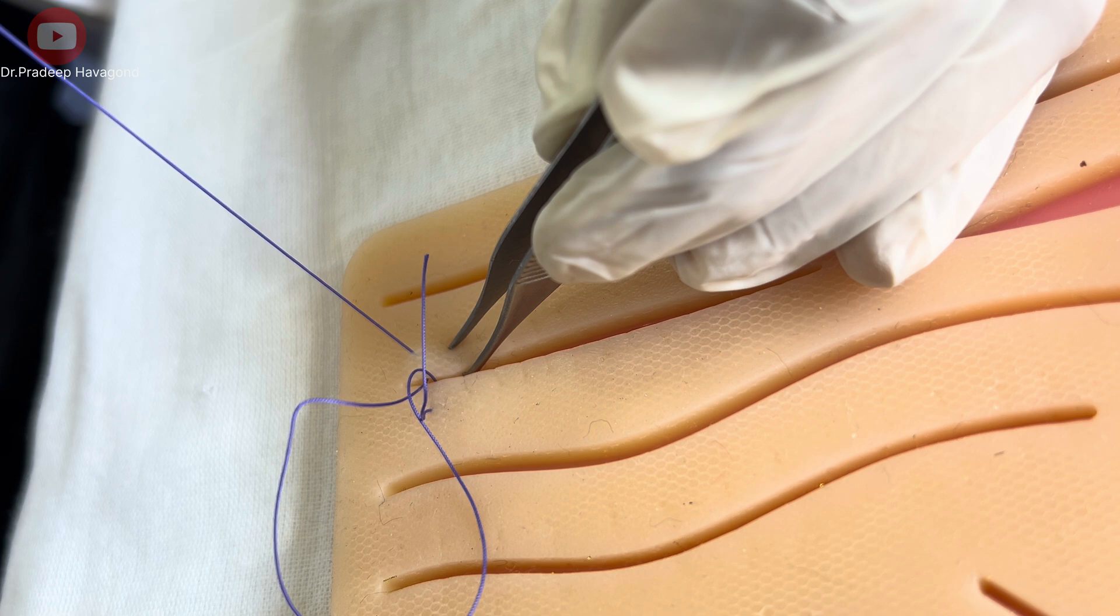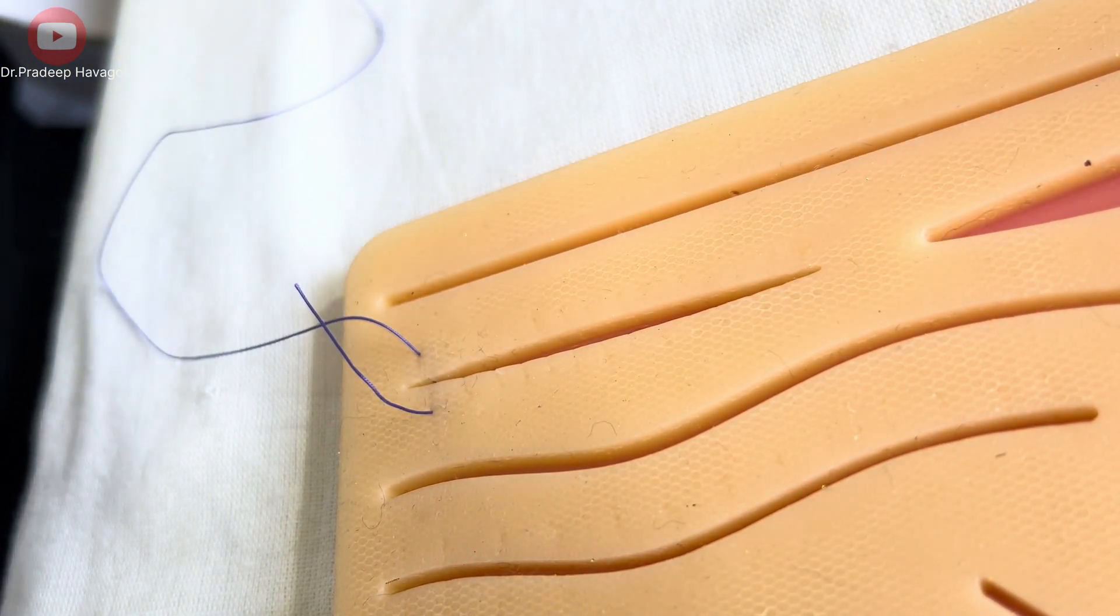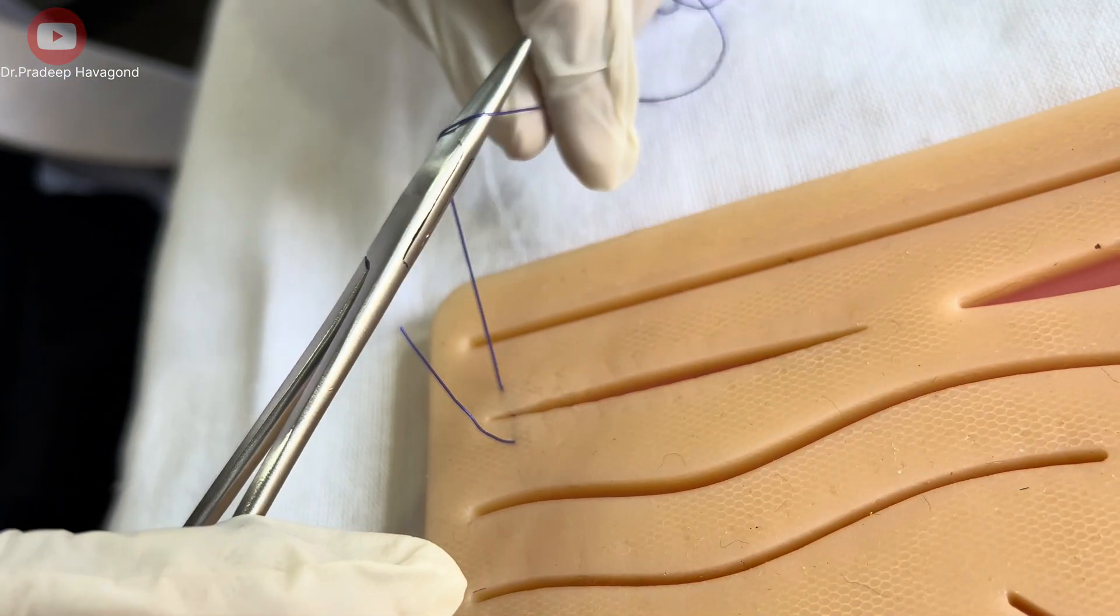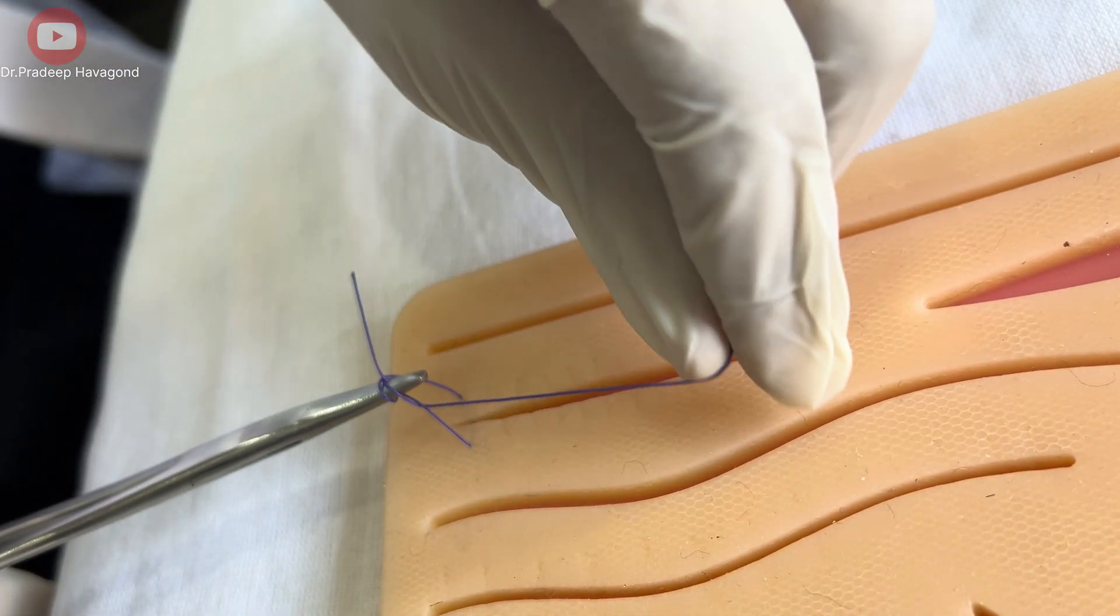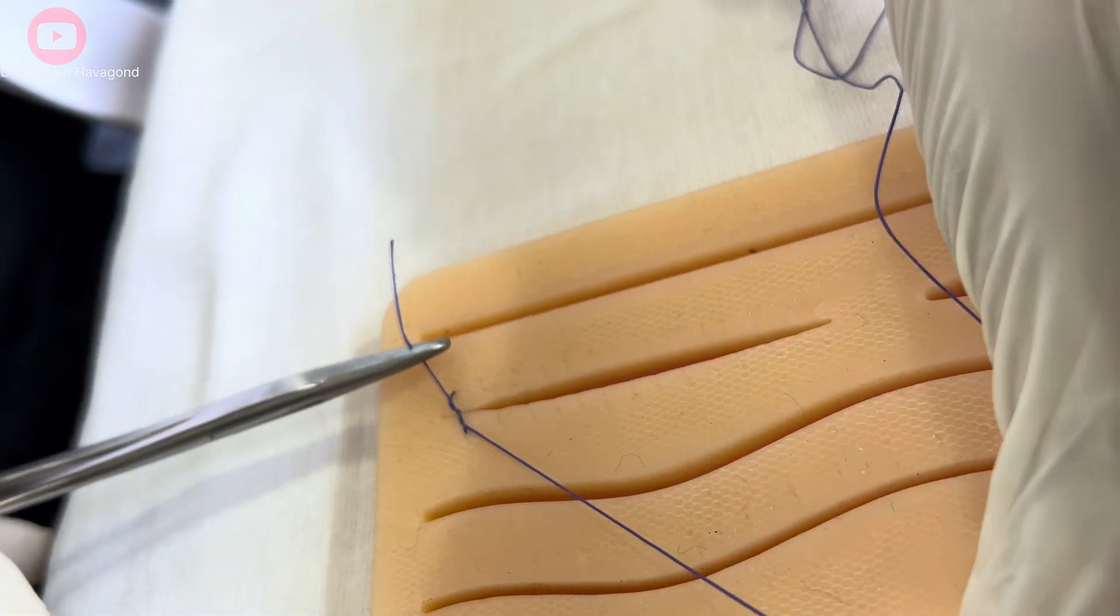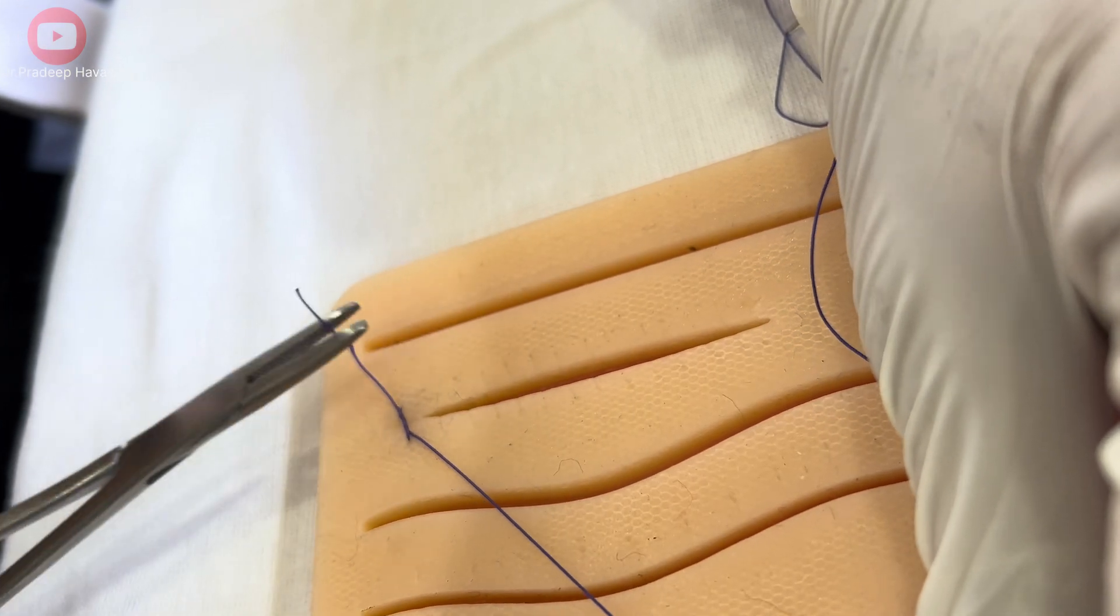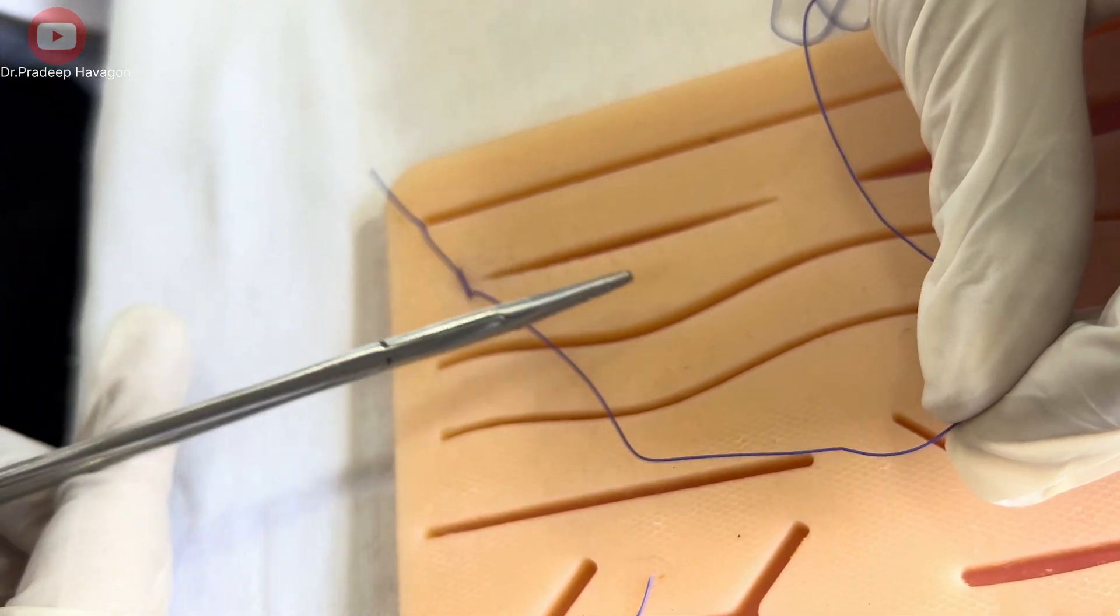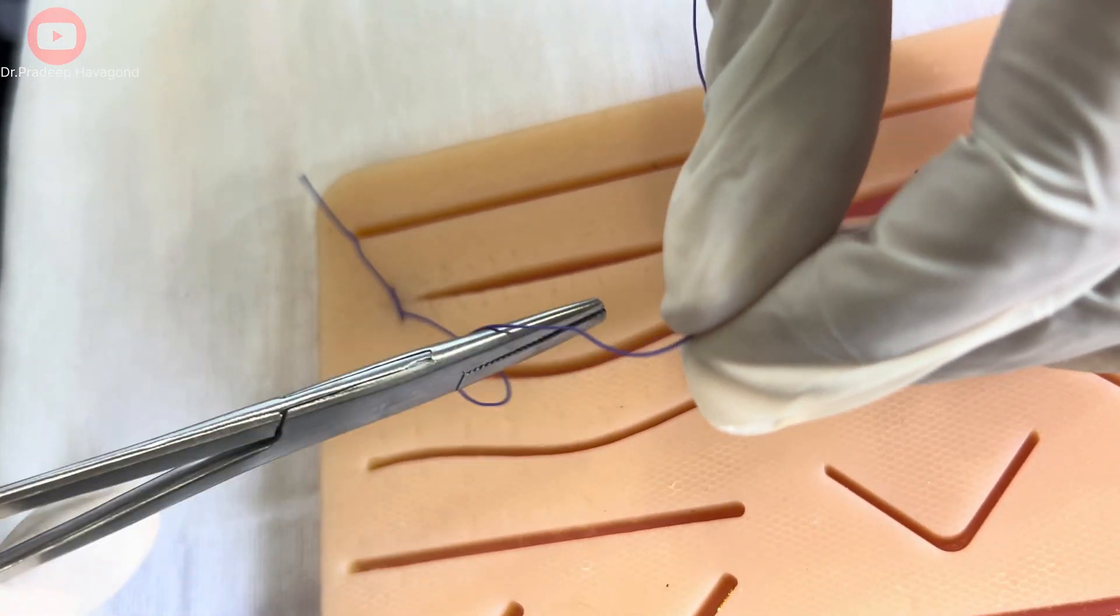Now, we will tie the surgeon knot here. Needle holder has to be held in one hand and long end of the suture on the other hand, and two throws have to be taken over the needle holder. Now, with the help of the jaw, you have to hold the thread. The short end of the suture has to be held, and its direction has to be opposite.